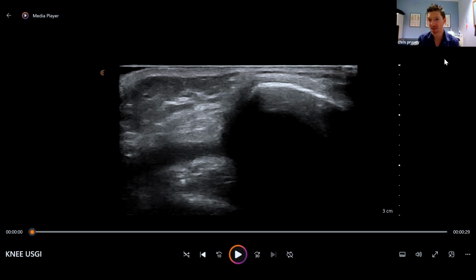But do I see anything differently there that I don't with this? I'm using a Clarius. No, I still get to the same sort of conclusion and diagnosis most of the time. It's like watching a TV in 4K. A massive 4K TV or a 14-inch, you're generally going to see the same things.